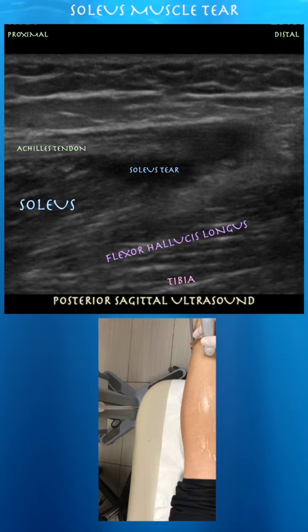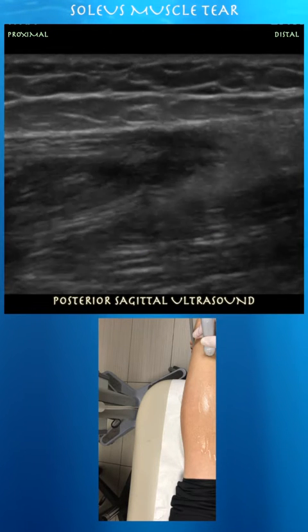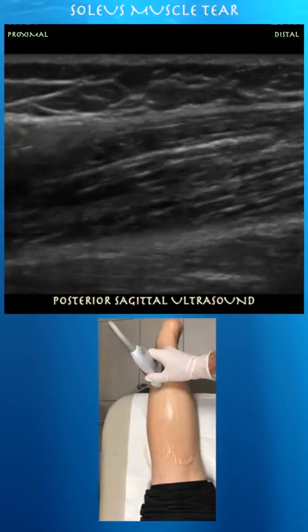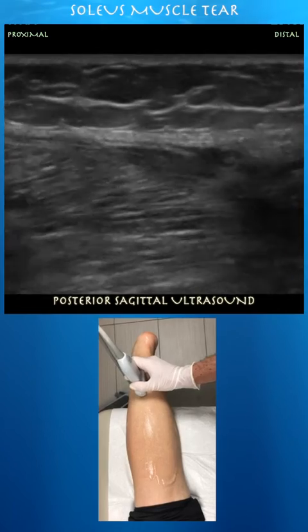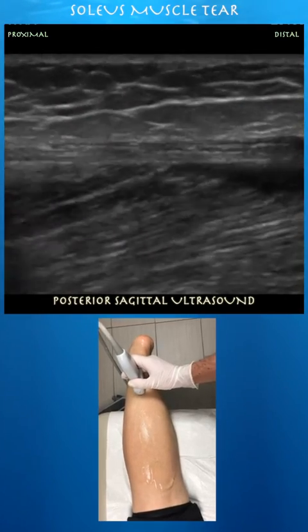Within the distal lateral soleus muscle, consistent with this tear. Again in a sagittal view, I'm just going through that region of the distal soleus muscle where she has that tear, and that's where she's tender with probe pressure as well.